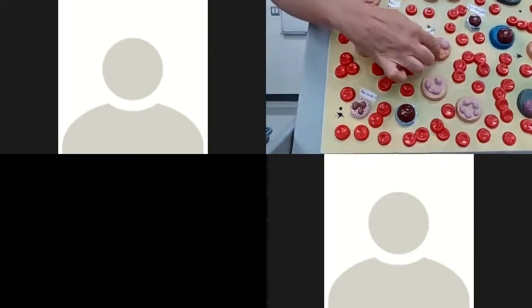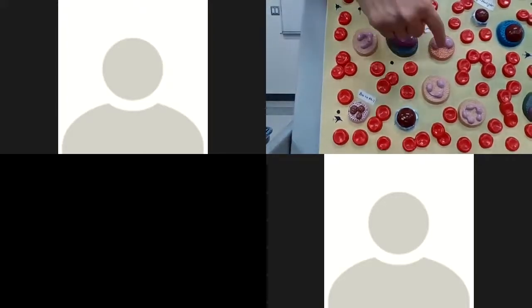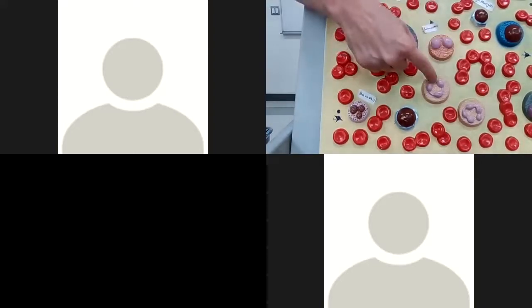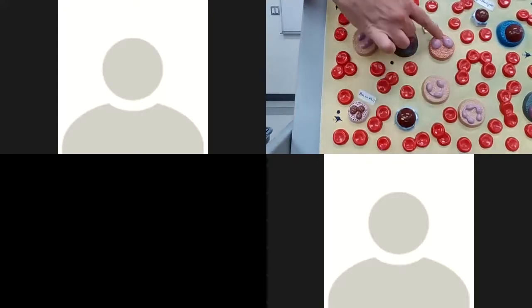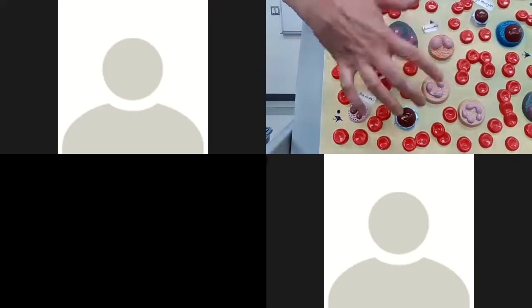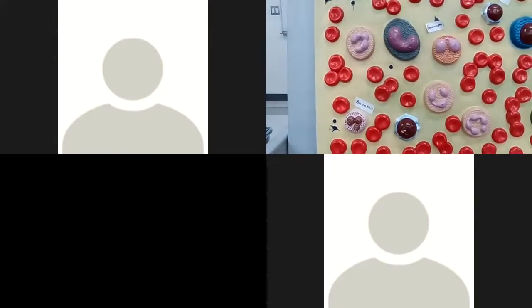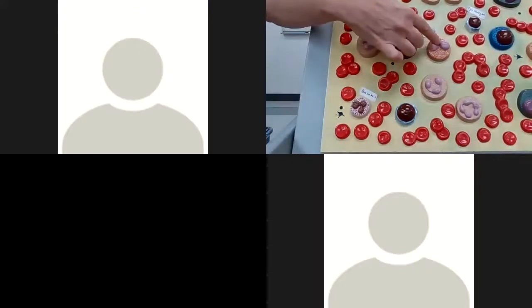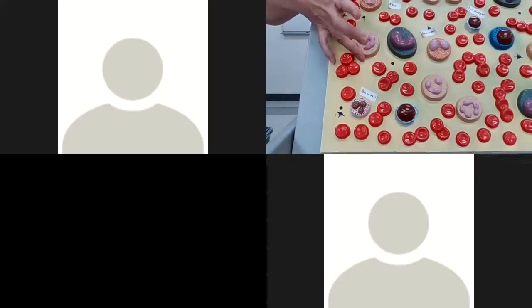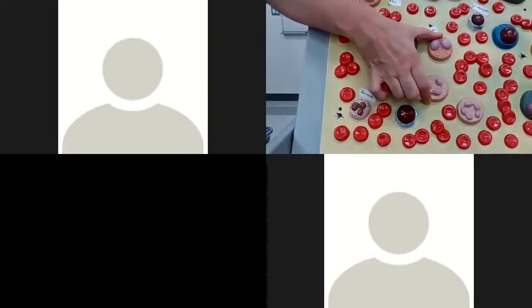Okay, the other one you can't see is this eosinophil, and there's one right here. It's going to have vesicles like the neutrophil because it spits first and then eats. The vesicles stain a little bit different in color because remember, if this guy's going to attack like fungus, this guy is going to attack like viruses. They're trying to cover their bases. I'm going to throw acid, you throw base, and one of us will kill it and we'll all eat the pieces, okay? And they're binuclear, so they make 2 lobes. These are eosinophils. And remember, from chapter 4, together these 2 guys were known as your microphages, okay?